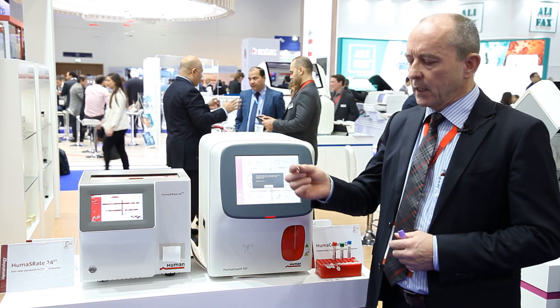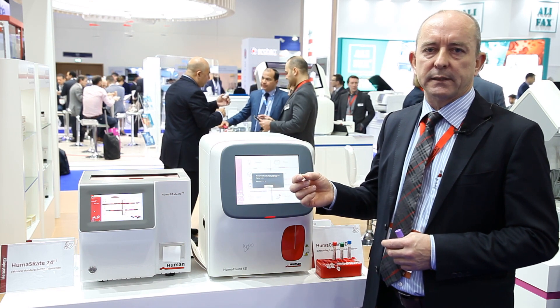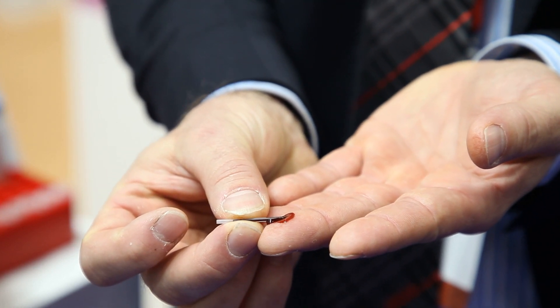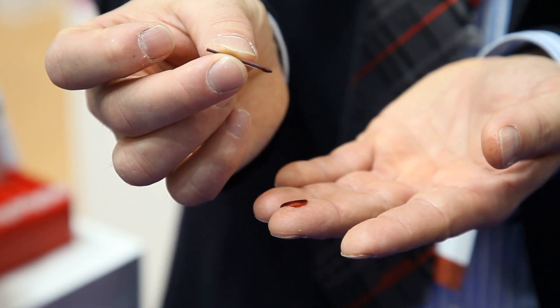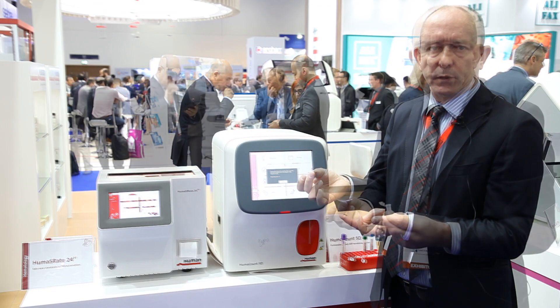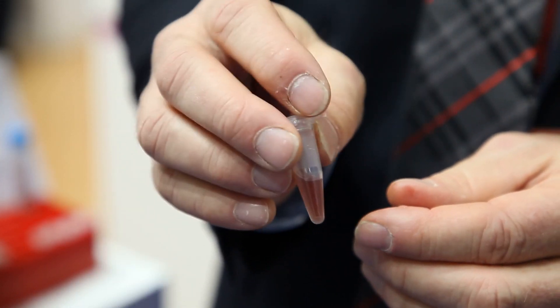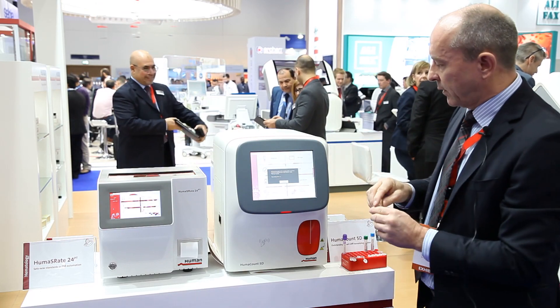In the pediatric clinics we now collect the capillary blood. Here you can see I punctured my finger and fill the capillary tube to the very end. Once it's full, we make sure there is no blood on the surroundings of the tip — we wipe that off and put it into the pre-filled bullet tube. I take the capillary blood sample and put it into the pre-filled diluent, mixing until the blood comes out of the capillary tube and the capillary tube is empty. We can now measure that sample on the analyzer.